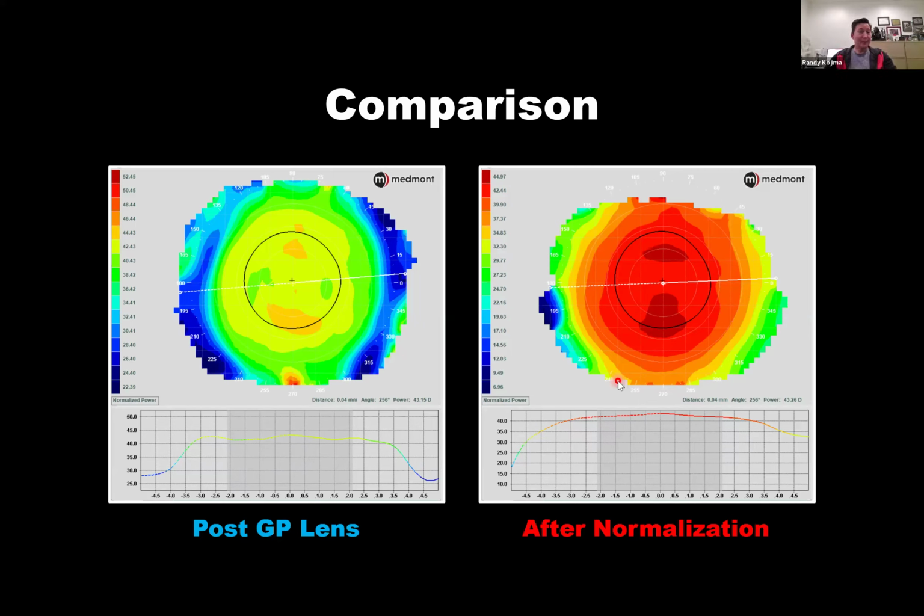Now, this will sound crazy, but I was seeing two sisters for Ortho K, and they had been wearing it for about 20 years, and they were noticing that their driving at night was becoming more problematic. They had some aberrations, so they wanted to stay in Ortho K, but they wanted to try to reduce the aberrations.